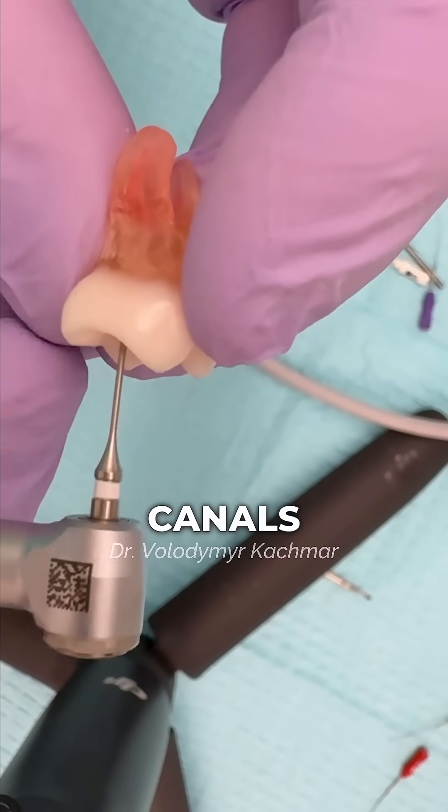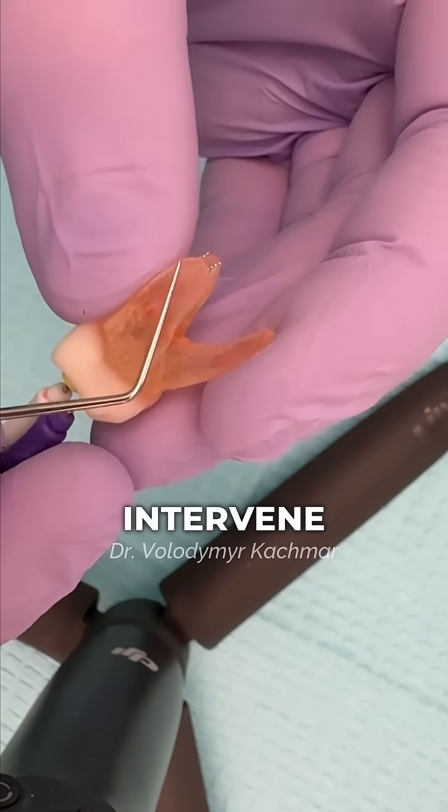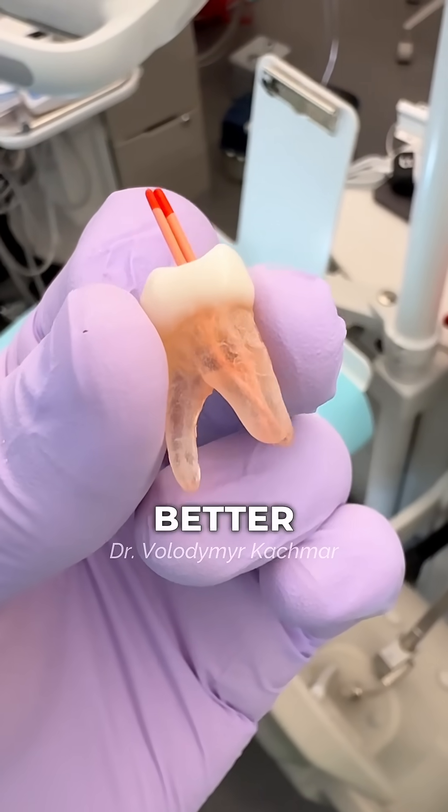Once you finish shaping all canals, it's time for obturation. MB1 and MB2 often intertwine or cross over each other, so I prefer filling them simultaneously for better adaptation.